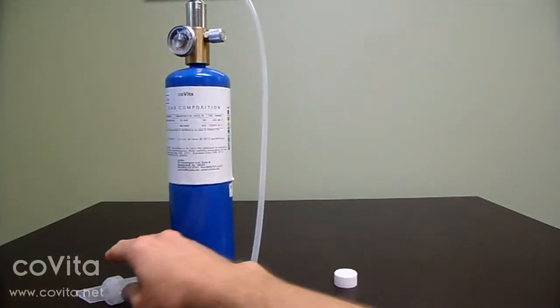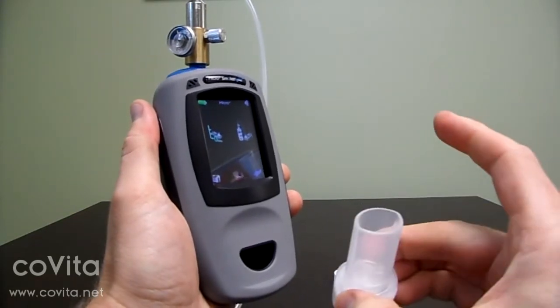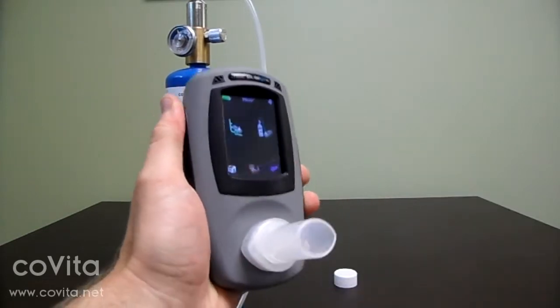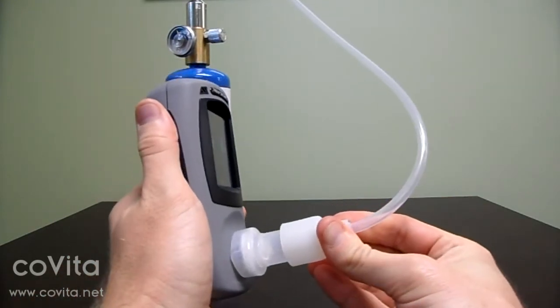Touch the check mark to accept the zeroing value. This will return you to the previous screen. Connect the D-piece to the monitor. Connect the large end of the calibration adapter onto the D-piece.